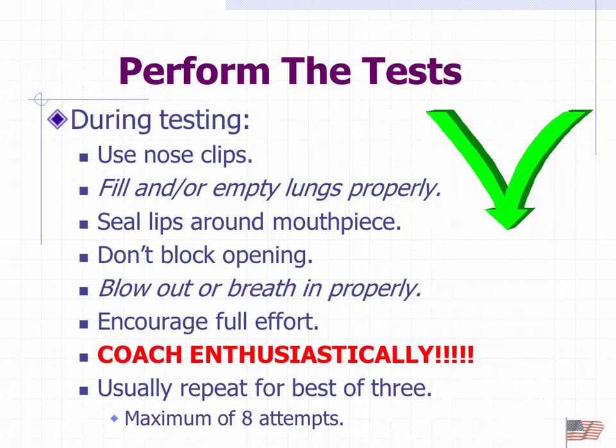And again, I'm sorry, I think I said 6 before, it's 8. So a minimum of 3, maximum of 8. The reason for no more than 8 is they get tired. You start seeing degradation in performance just because they're pooped out. I can't even do 3, and I'm beat.